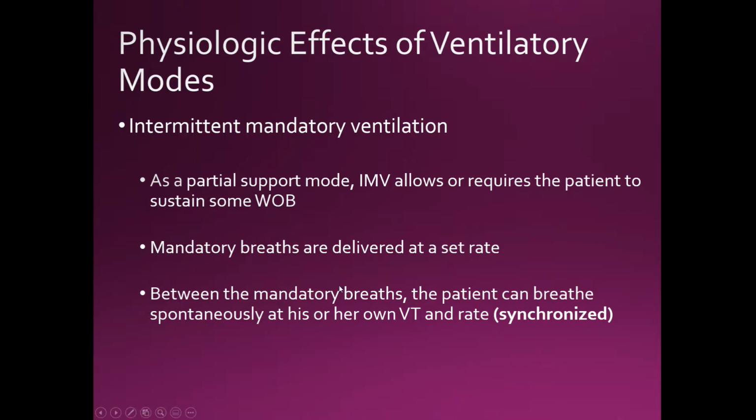Okay, so mandatory breaths are delivered at a set rate. So we do have what we call a backup rate here. So if the patient is not breathing, let's say, one breath every 6 seconds, the machine will kick in. Between the mandatory breaths, the patient can breathe spontaneously at his or her own tidal volume and rate.